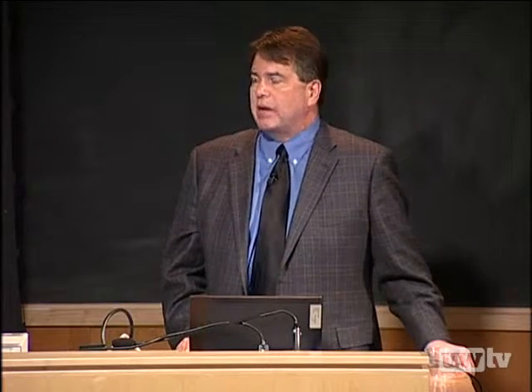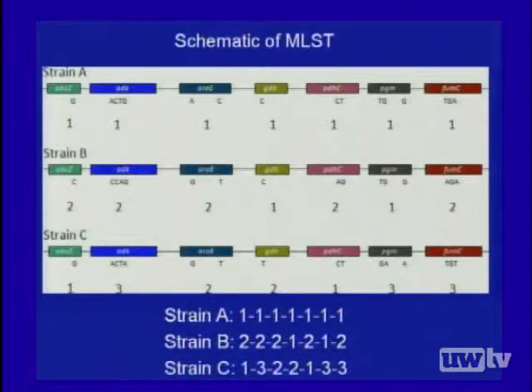So even then, this is a great advance when it came along, and it was used extensively in public health in about the mid-80s, but it is simply not used anymore. Because instead, we're starting to use the MLST. And here's an example of an MLST.